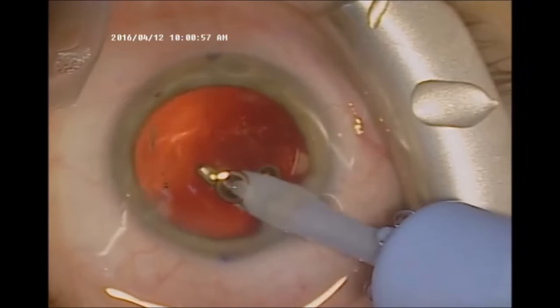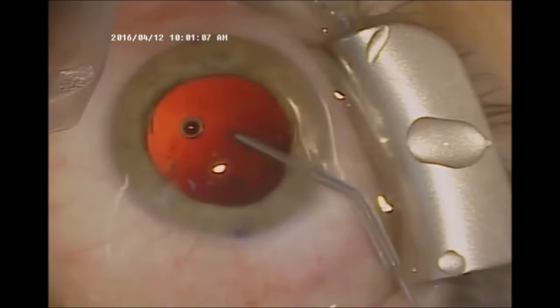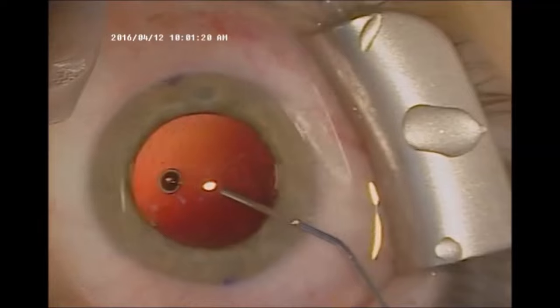Now that all of the cortex or the remaining lens material has been removed, I use a silicone tip in order to free up any remaining lens material that I've missed, called polishing.